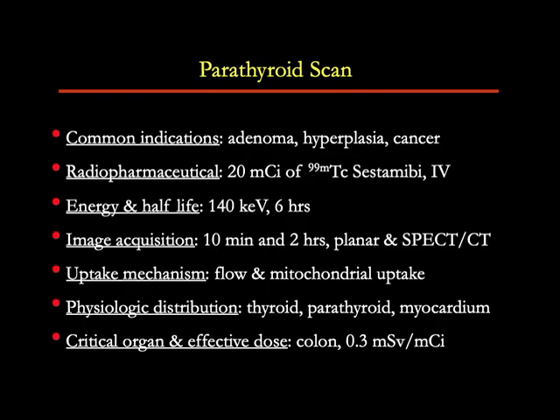So the reason we do parathyroid scans is to localize parathyroid adenomas, the most common cause of primary hyperparathyroidism, to evaluate patients who are suspected of having parathyroid hyperplasia and rarely the patients who have a diagnosis of parathyroid carcinoma.